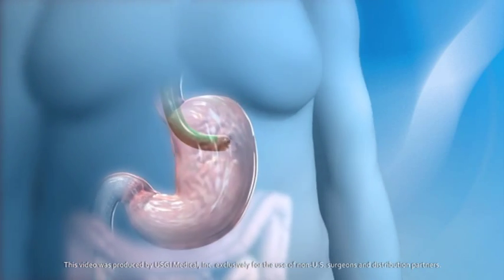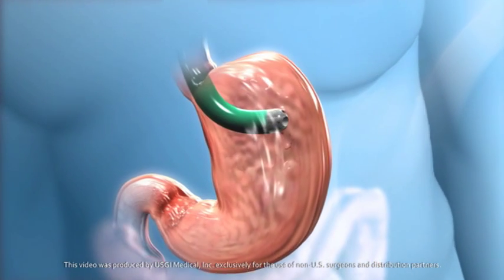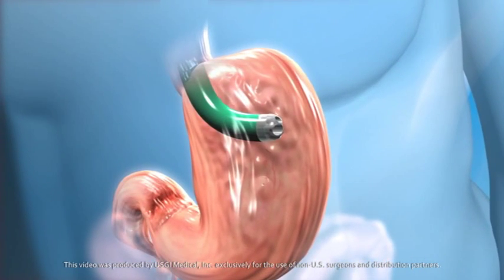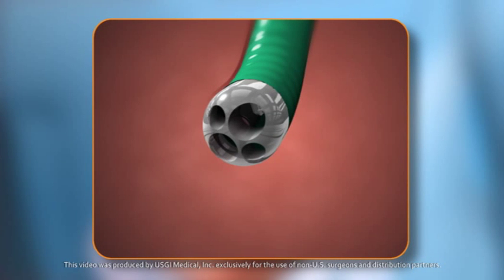Surgeons are now using new instruments that are easily passed through the mouth, through the esophagus, and into the stomach. The tip of the device can be turned and locked in place, providing a stable platform.